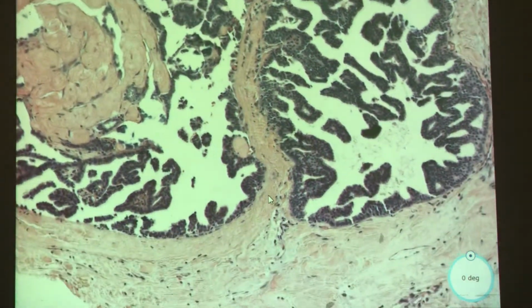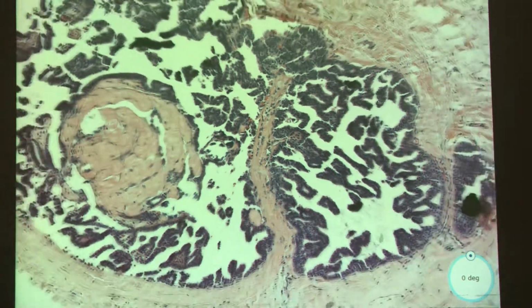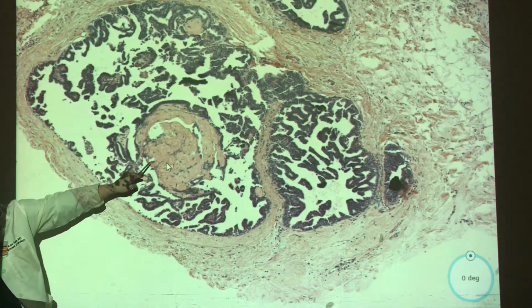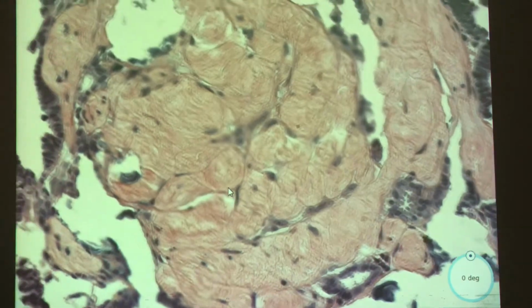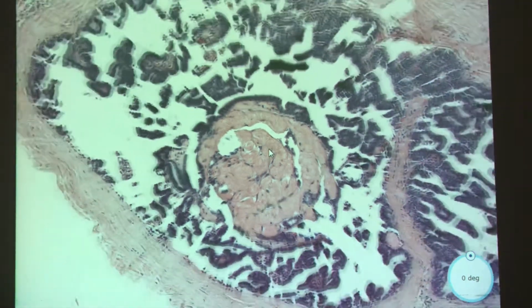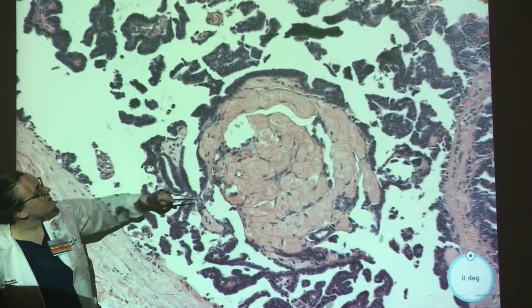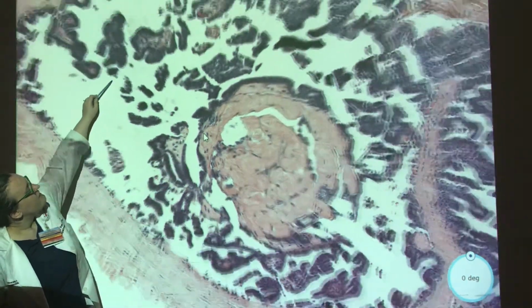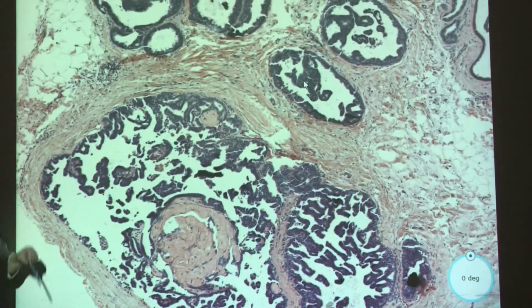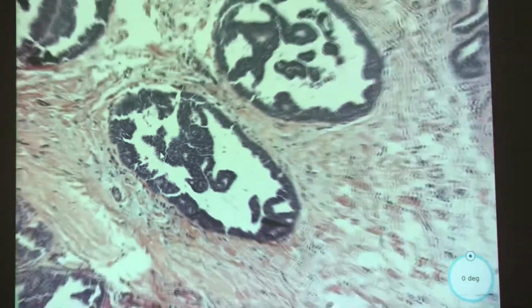Would you consider this? Well, this is probably stroma in between, maybe. And what about this part? That's probably a papillary core. Yeah. So they can be highlighted, so you see a little bit here, a little bit there, but like you said, there are no cores in those, right? Yeah. Or these ones here. Yeah, a little bit.